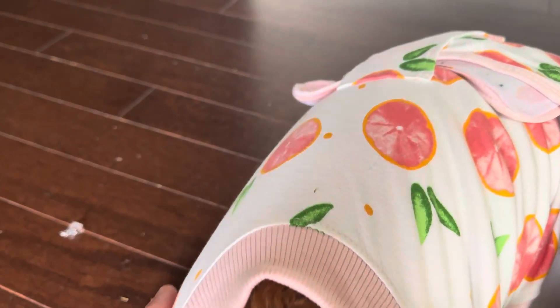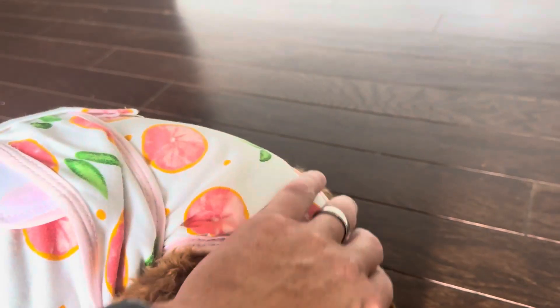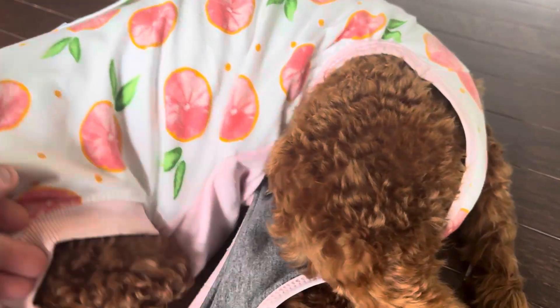So we ended up buying this in a cute pattern. There were like 17 different patterns to choose from, so that's the only downside — there's so many different options. But simple how it works: this Velcro is right here. It's important that this Velcro is up top. It keeps the bottom part actually high.